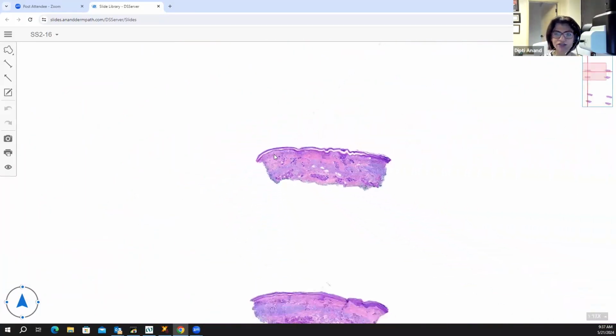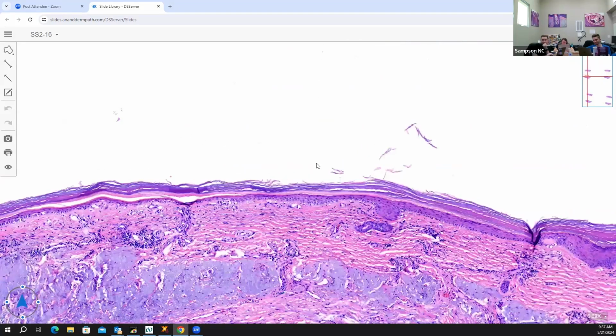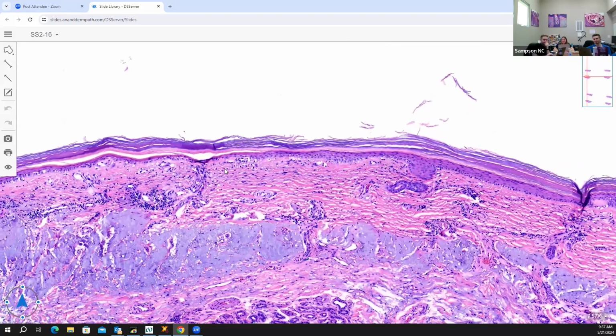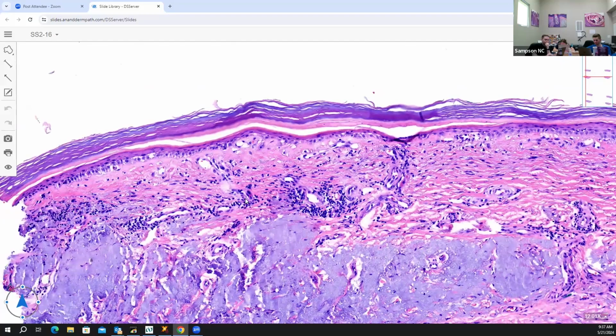Why are you guys all going down the stasis route today? Well, I saw the vacuolar thing, but it's so thin I couldn't tell. Stasis actually has a thick epidermis. It's either ulcerated or thick. I've never seen an atrophied epidermis. I always imagined it on really sun damaged legs where they're super thin, but no, that's my imagination playing tricks on me. They look like cannonballs with a thick epidermis on top, and it can be ulcerated if there is an associated stasis ulcer.